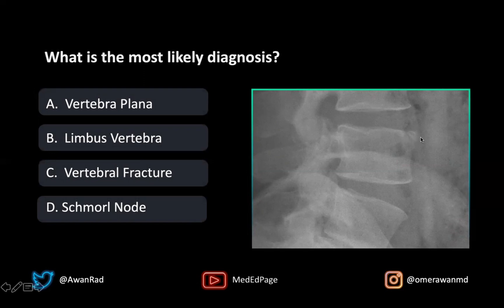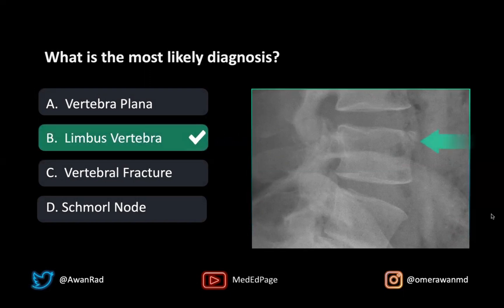What we see here is a well-corticated ossific fragment adjacent to the anterior superior corner of the L4 vertebral body. This, of course, is a limbus vertebrae. It's certainly not a vertebra plana because that would be marked flattening and compression of a vertebral body, which we don't see. The vertebral height is maintained.